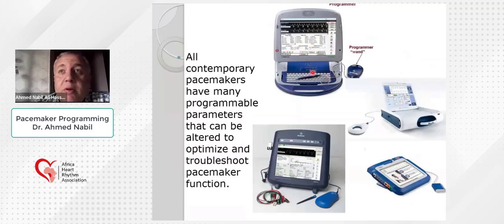Of course, programming is conducted with different programmers. Each programmer is dedicated to a certain type of device, like, for example, the Medtronic programmer for the Medtronic devices, the Merlin for the Abbott or St. Jude devices. This is the more recent programmer for Medtronic, and of course different companies have different programmers.